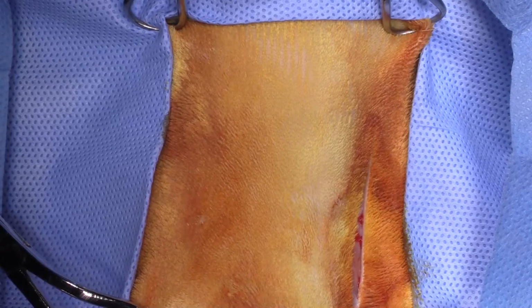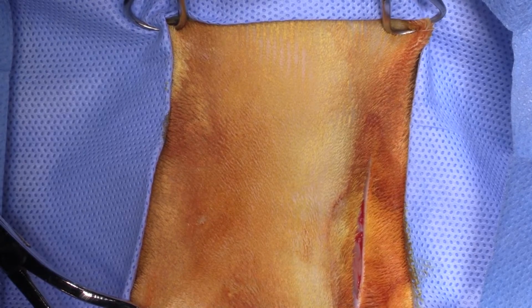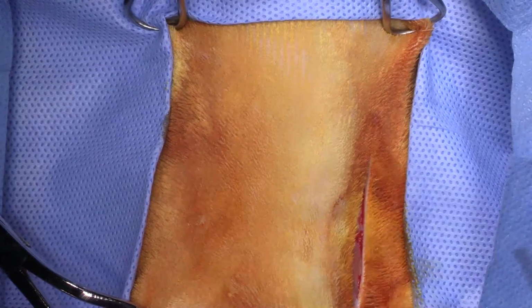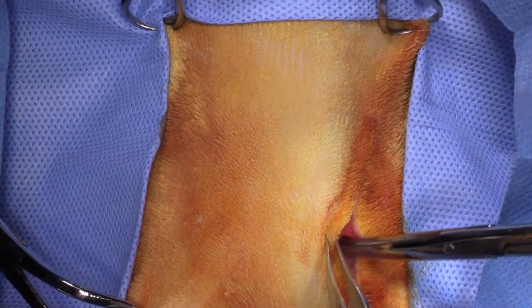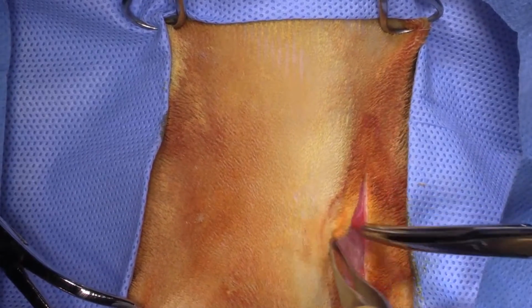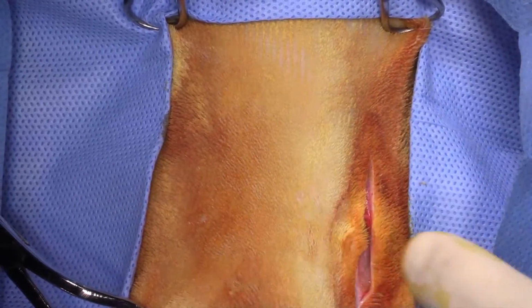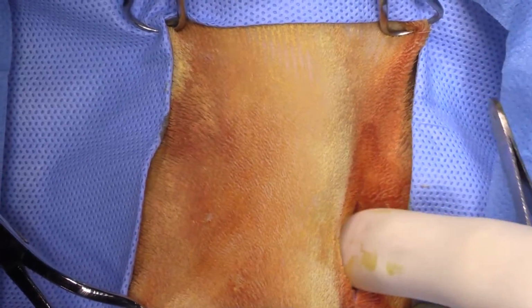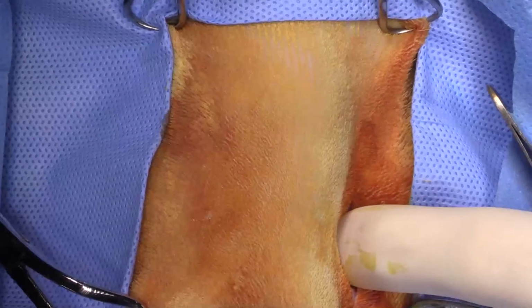Linguofacial vein will be lateral. You'll see our facial artery, also lateral, and the hypoglossal nerve will be medial, and probably the most important structure would be that hypoglossal nerve, so we'll want to be really careful to avoid that. Remember that cat bullas have two chambers, and we have to make sure that we get into both chambers, or we'll have recurrence of clinical signs.